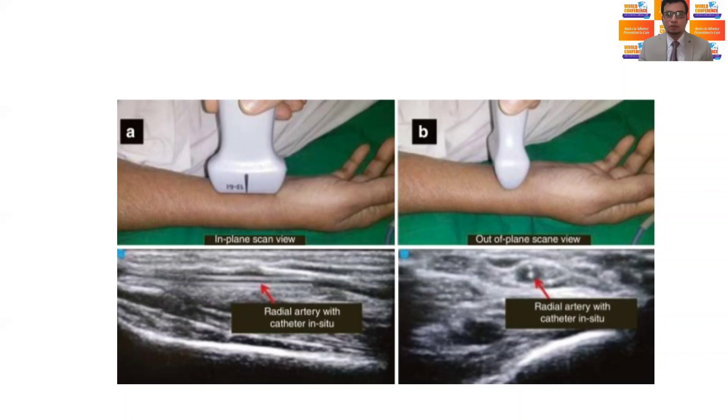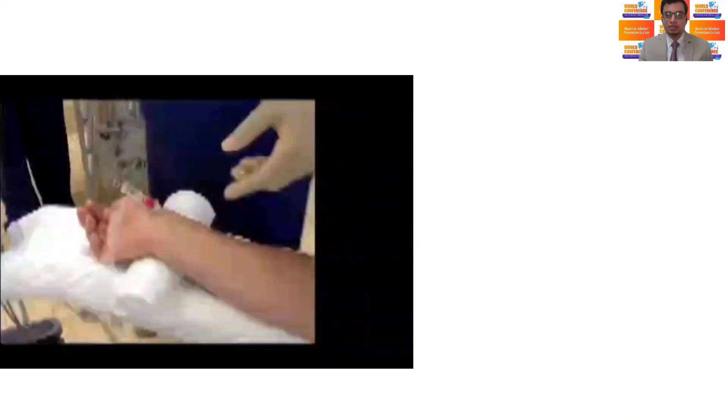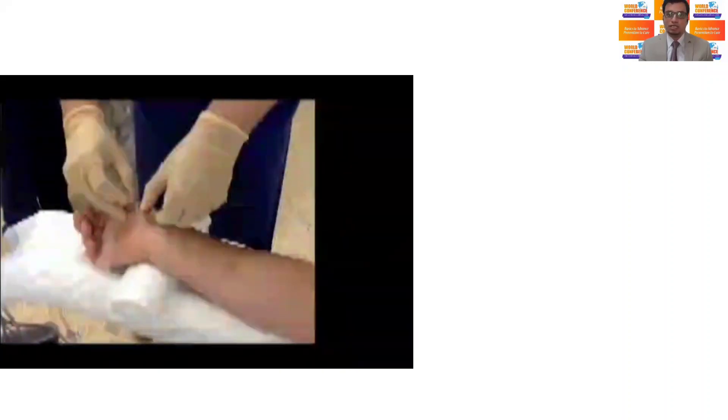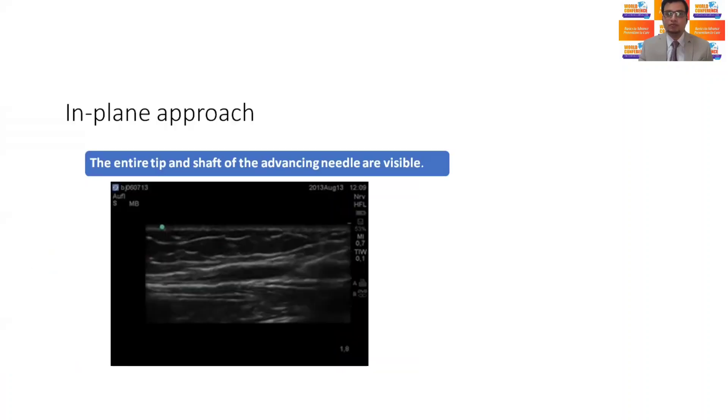Using in-plane approach, the radial artery is scanned in-plane. The long axis of probe is kept in line with the long axis of artery so that it scans the longitudinal section of the artery. The advantage of this approach is the real-time visualization of tip of the needle entering inside the lumen. However, it requires good expertise to hold and stabilize the probe during the procedure.